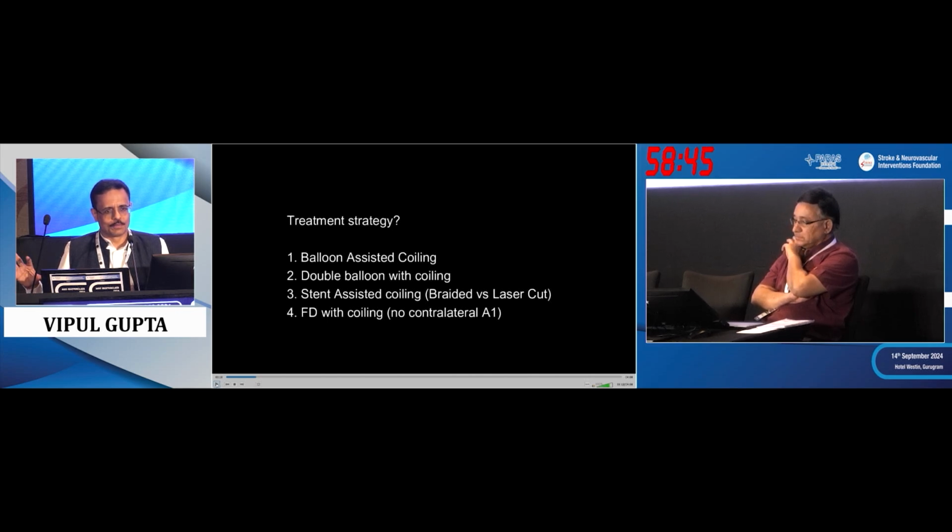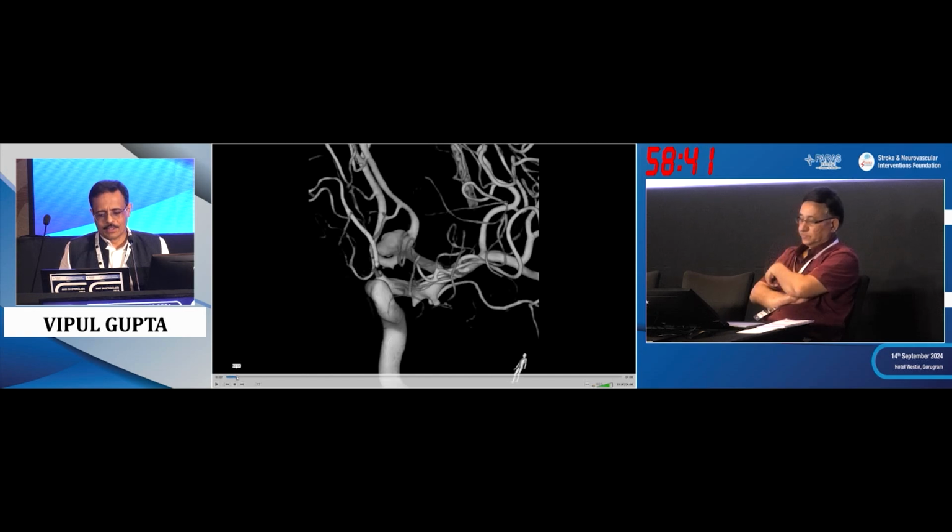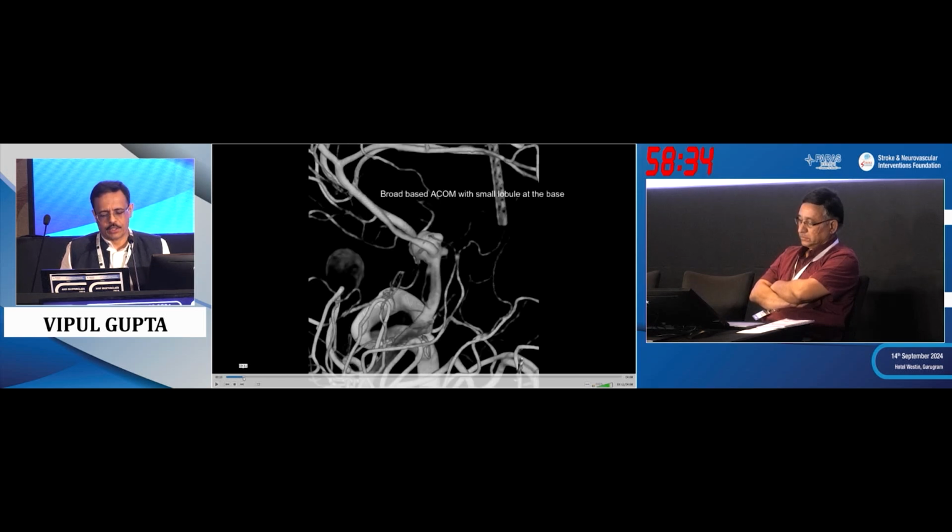you do. Can you show me just the... Again, let me go back. Yeah. This is the bifurcation. Ruptured? Yeah? It is ruptured? Yeah, this is ruptured. We'll try with balloon and coil, yes. Yeah. In fact, when I looked at it now, I thought, okay, we can balloon and coil.